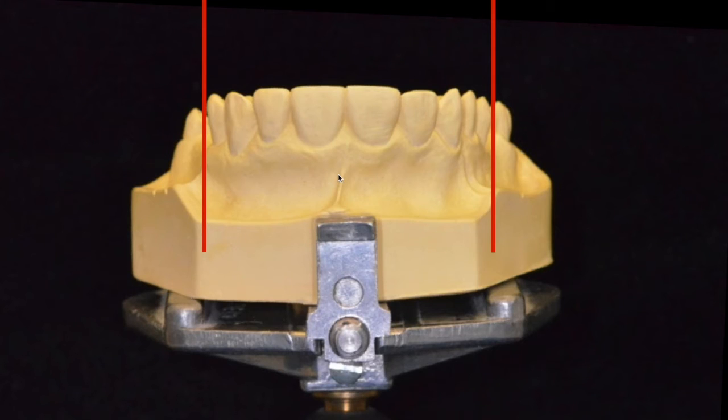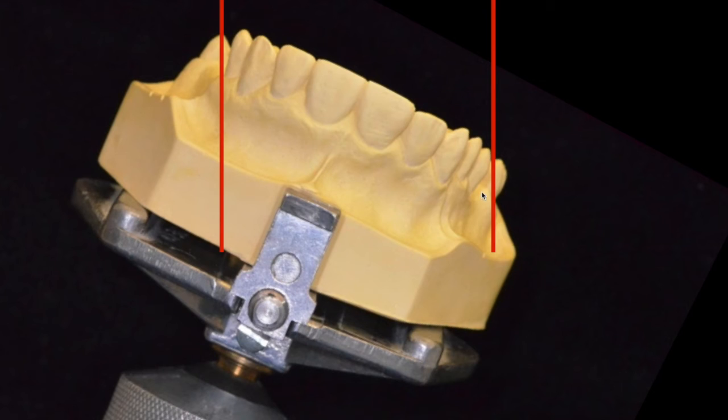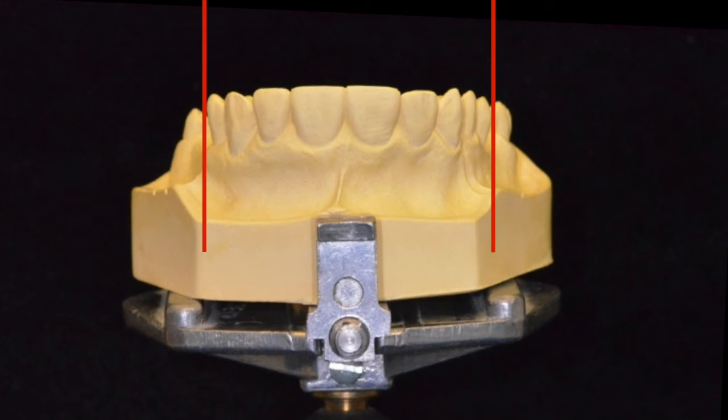In the lateral tilt, meaning that when you're looking at the cast in the frontal view, you try to look at the buccal surface of the abutment and make the undercut amount even, so there is equalized retention on both sides. When you tilt this cast to one side, the tilted side will increase the amount of retention. On the other hand, the other side of the abutment will decrease the undercut amount. So this is not what you want. Instead, you want equalized undercut amount on both sides so that the retention amount will be equally distributed.